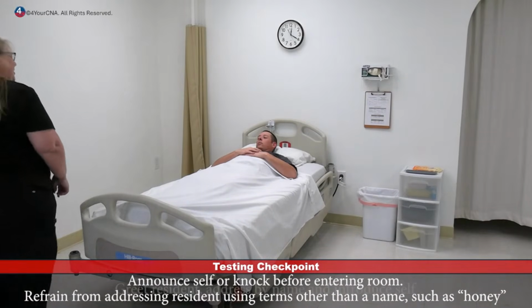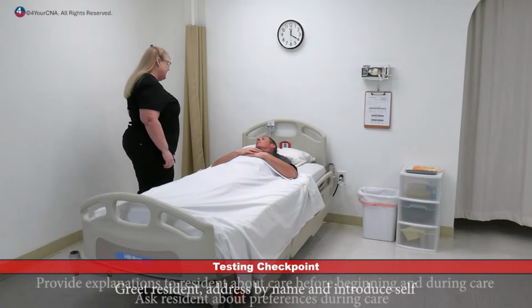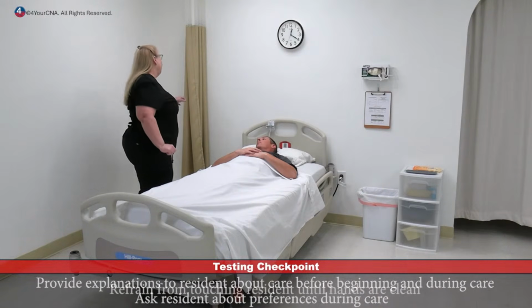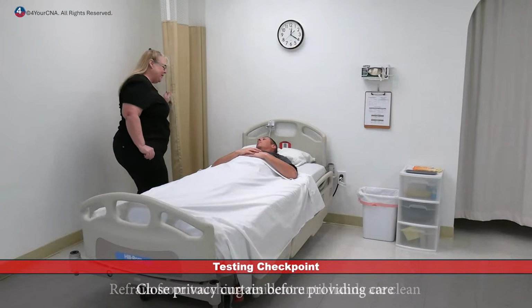Hello. Hi, Mr. Jones. My name is Patty. I'm your CNA today. How are you? I'm well. How are you? Fantastic. I understand you need a bedpan. Can I help you with that? Yes, please. Okay, I'm going to close your curtain, wash my hands, get my supplies, and I'll be right back.